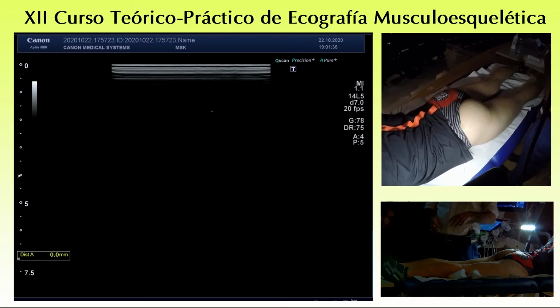In fact, when you perform it in CT or MRI, sometimes it's much easier and more objective, but with ultrasound, somebody said that you can also check for that. Of course, the main finding when there is an impingement is an alteration of the ischiofemoral bursa that you can perceive in that area with ultrasound.